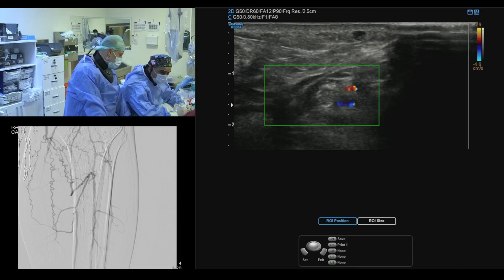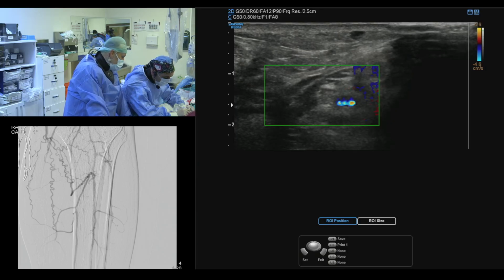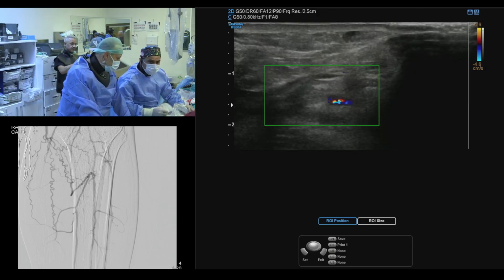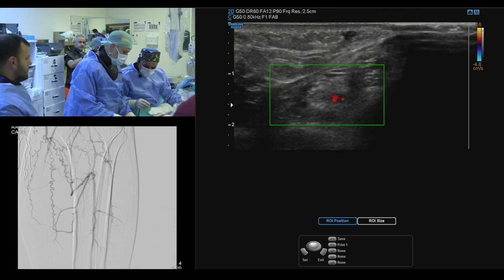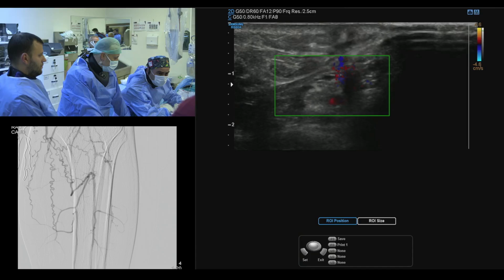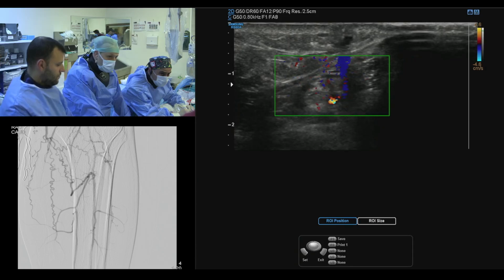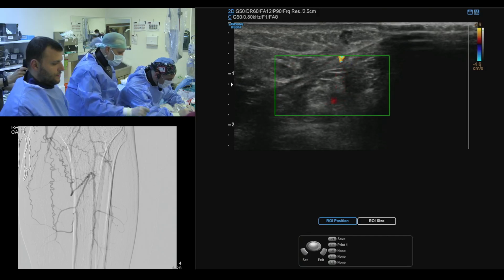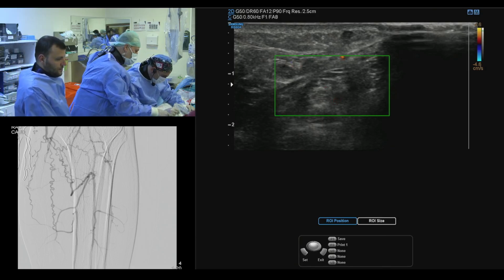What is your opinion on the antegrade approach? You are a senior cardiologist in this field. We know you. But if your retrograde access fails, then you can try the antegrade option, at least from three other views: anterior posterior, left anterior oblique, right anterior oblique, and lateral.